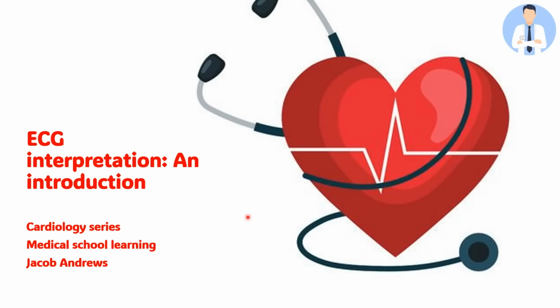Welcome to part 7 of this cardiology series, where today we're going to be doing an introduction to ECG interpretation. And we're also going to be going over some general cardiac and ECG principles too. Okay, so with that being said, let's get straight into the video.